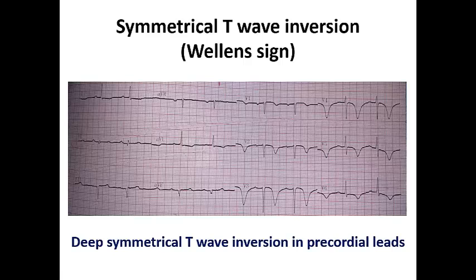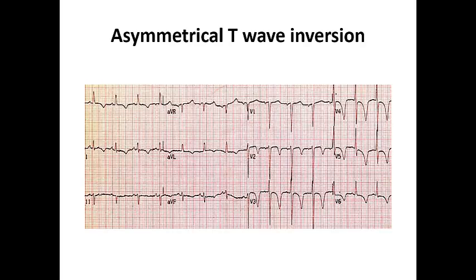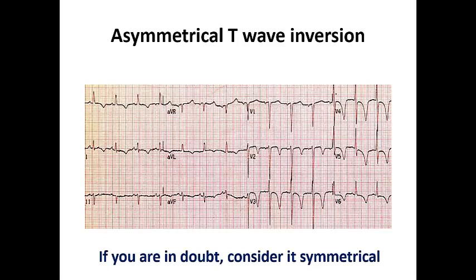In this ECG example, the T-wave inversion appears asymmetrical, as the descending limb descends slowly and the ascending limb ascends rapidly. If you are in doubt and cannot decide whether it is symmetrical or asymmetrical, consider it as the worst case and admit the patient, check serial ECGs, and check cardiac markers to determine whether it is suggestive of ongoing myocardial ischemia or just a strain pattern due to structural heart disease like LVH or cardiomyopathies.